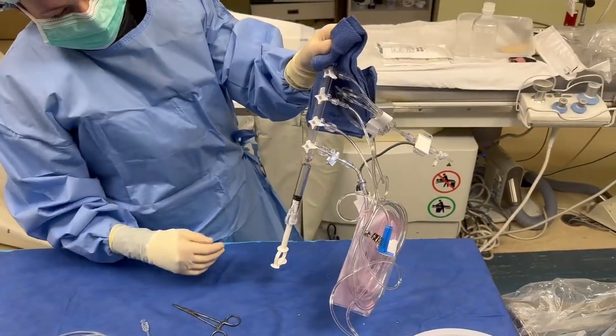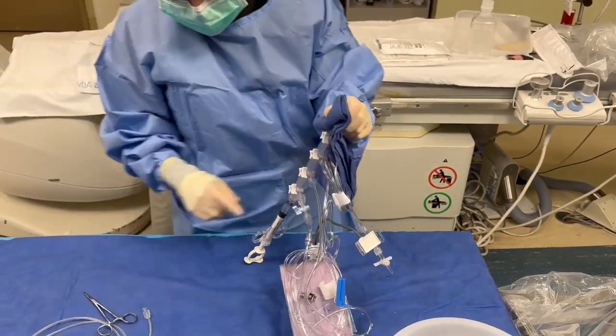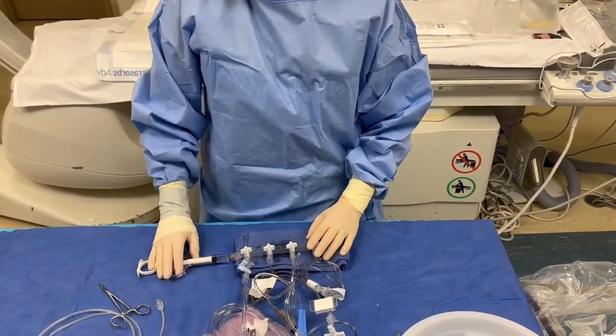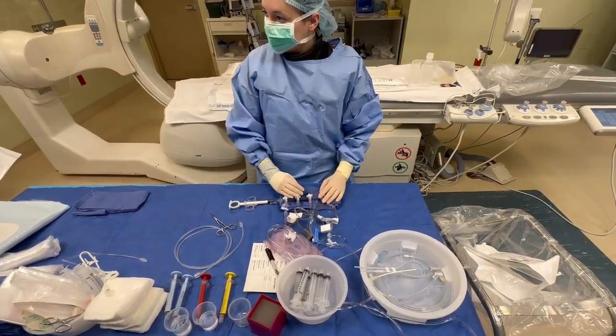Turn it back on. Fill it up. Now, you will have little bitty baby bubbles — we're not worried about those. We're worried about the big ones. So now this is flushed, this is ready to rock and roll. The only thing that has not been flushed is your waste port, but in theory you can't draw back off of this.